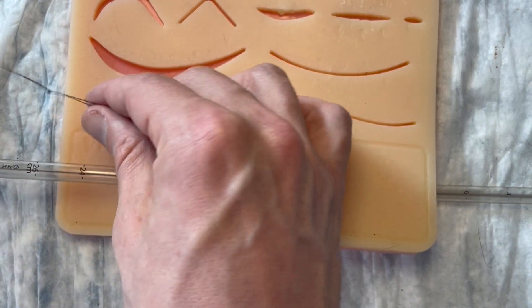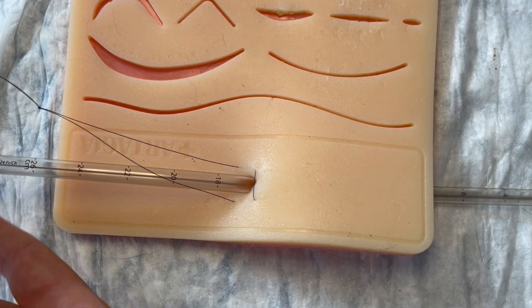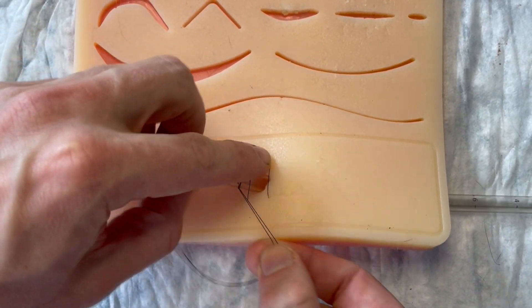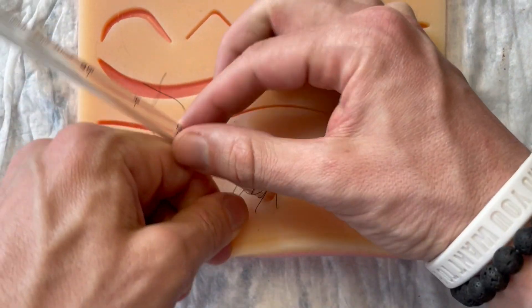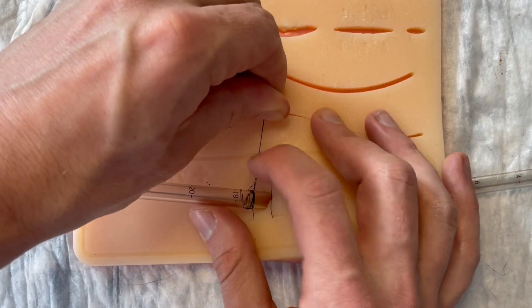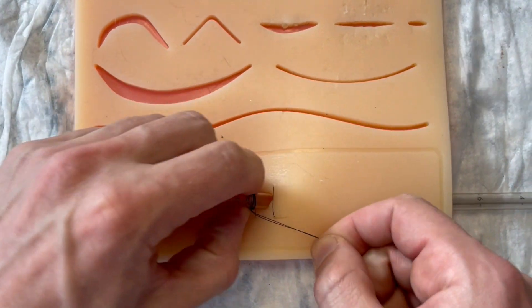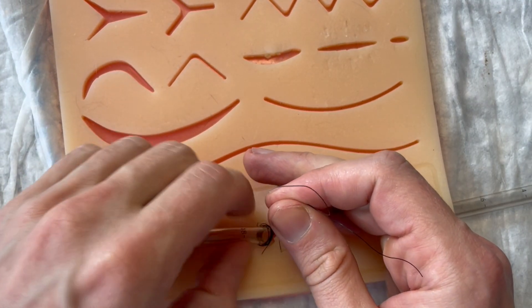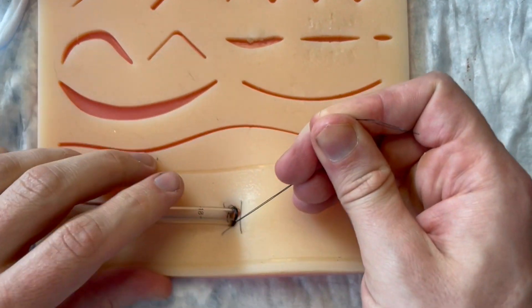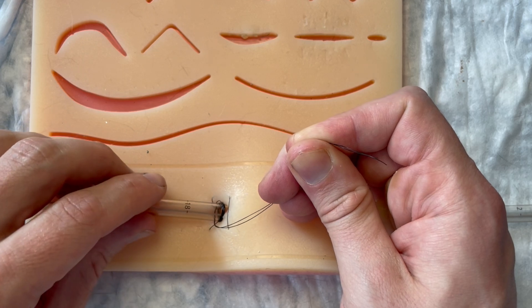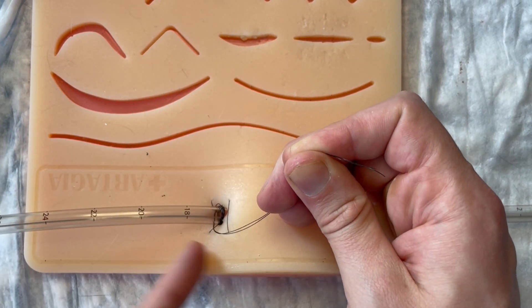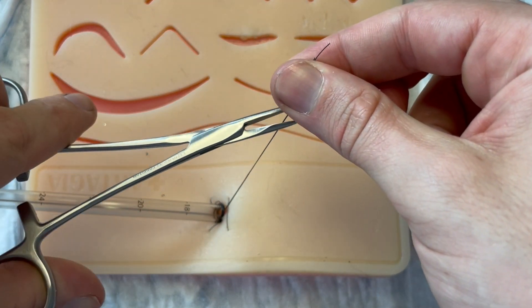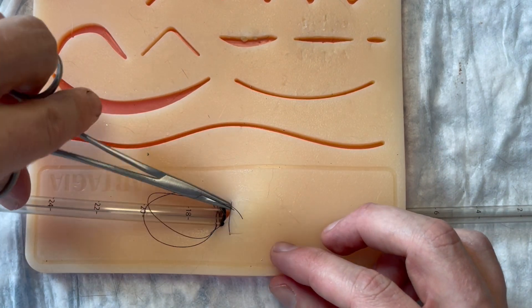All right, so we've got our knot right here and what we're gonna do now is we are just gonna start wrapping this knot at the base of the tube and just wrap that around, until our knot loops around. So we've got multiple loops in place, we've still got our string here. Want to get that as close as possible to the base, so the tube anytime the tube is able to be dislodged and then goes back in you're then creating bacteria into the pleural cavity which can cause an empyema. So now we've got the two ends of our string here, we can just grab a hold of that and now we're going to slide it underneath.